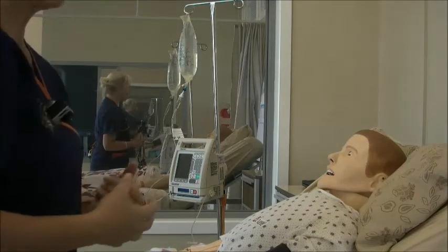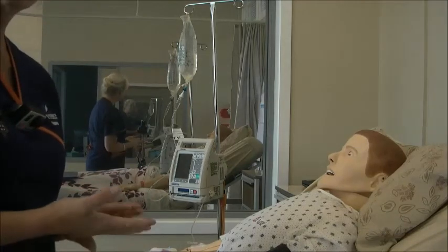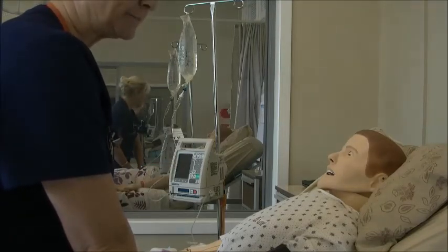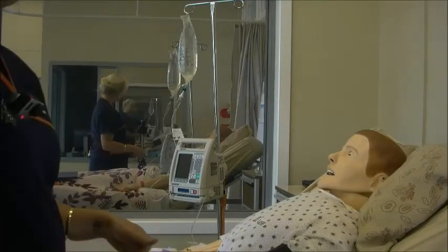Remember to describe when you're doing pulse, the rate, rhythm and depth, so make sure that you let your tutor know, or you can ask to make that assessment. The next thing I do is just have a quick look.